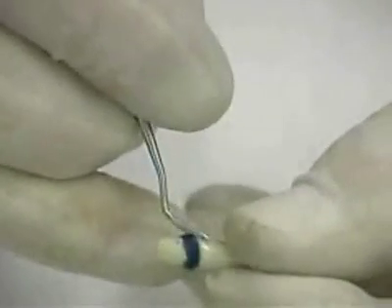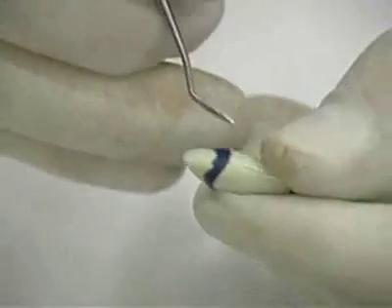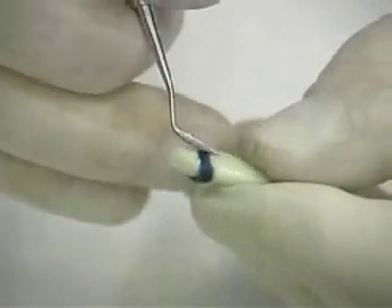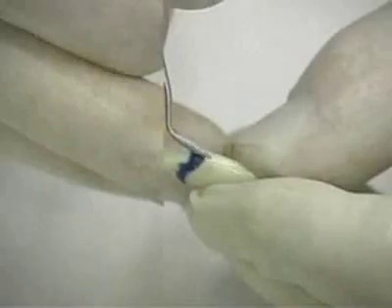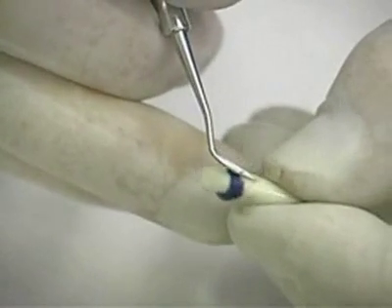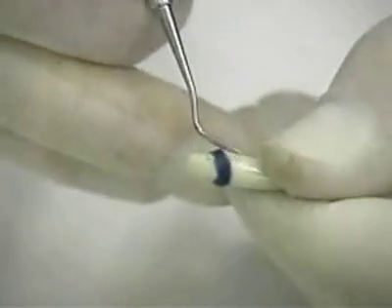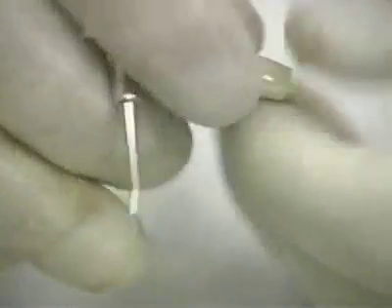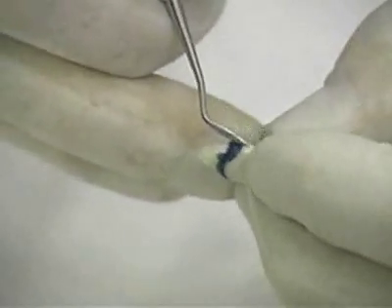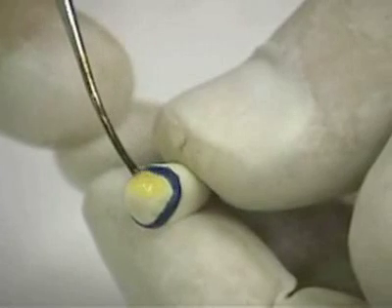After sealing, use the Carver or number 4 instrument to remove the excess wax from the margin. Use the root form of the tooth to help clean the tooth by placing the instrument against the root and carefully scraping the root and any excess wax with it. Once the margins are sealed all around, cover the entire tooth with an even coat of wax.